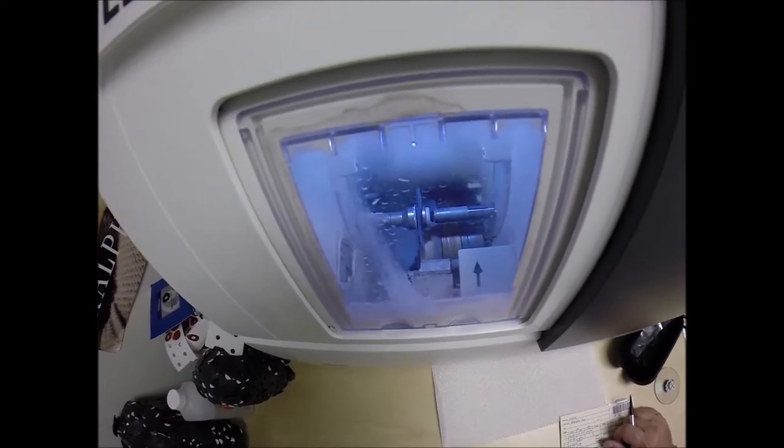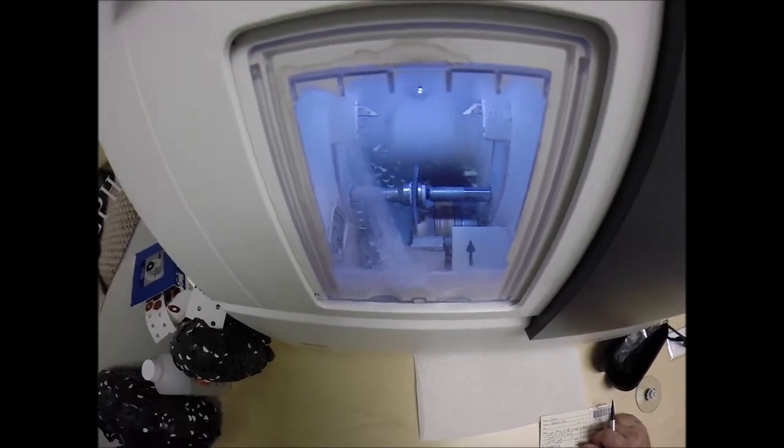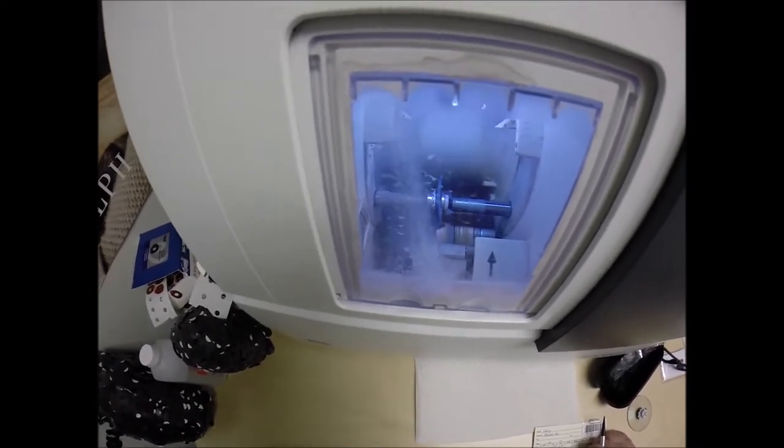These Zeiss Photofusion lenses, same as the Transitions Extra Active, they block 50–70% of the harmful blue light emitted from today's electronics, such as computers, tablets, cell phones, and of course the number one cause of blue light, the sun.